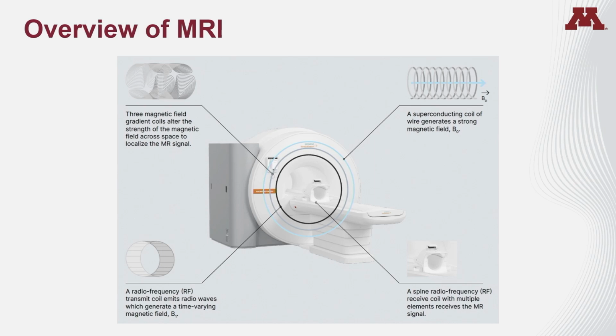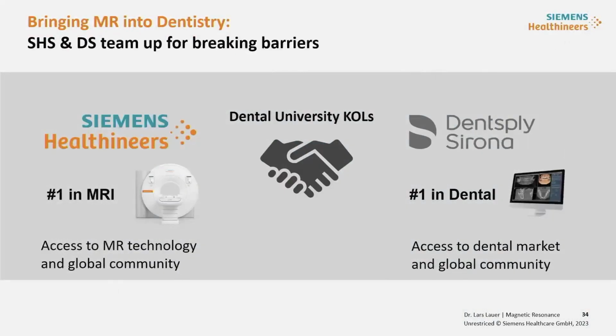And so the parts that I was telling you about that they've been working on obviously is the gradient coils, the magnet itself. The magnet itself is smaller while it has the same form factor. It looks like a big scanner. It's about 2/3 to 1/2 the typical size, and the siting requirements are smaller. So they've made it somewhat smaller. It's not yet a cone beam CT size, but there's clearly a desire that that's where dentistry is going to want to go with it if dentistry is interested in keeping MRI in their practice.